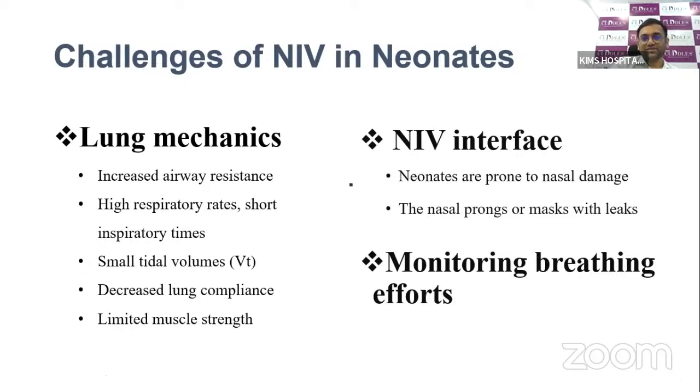Not only with these lung mechanics, even with the equipment, the nasal prongs or masks sometimes may not fit properly on the neonate, and they may be moving. Because of inadequate humidification, there can be water condensation in the masks and tubing that can lead to either a leak or nasal damage. They also have irregular breathing, periodic breathing, and the efforts may not be great. So it is very difficult to monitor the breathing efforts in the newborn. These are the various challenges to providing non-invasive ventilation in these units.